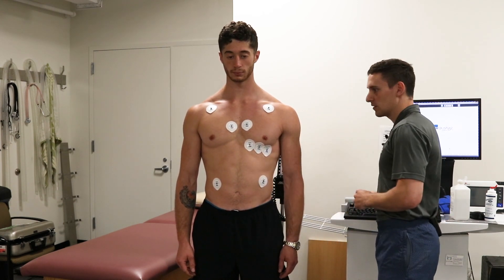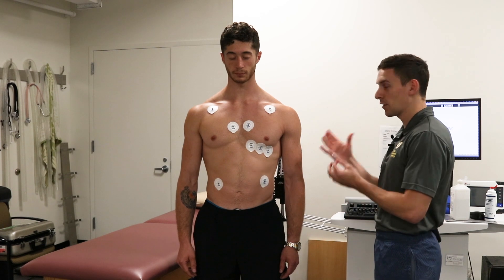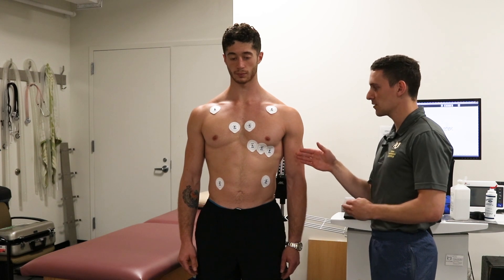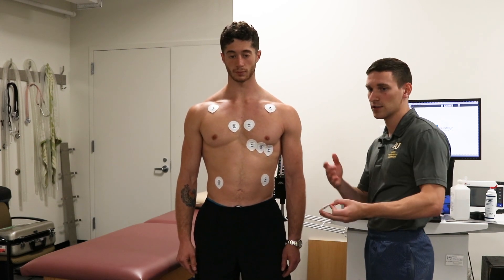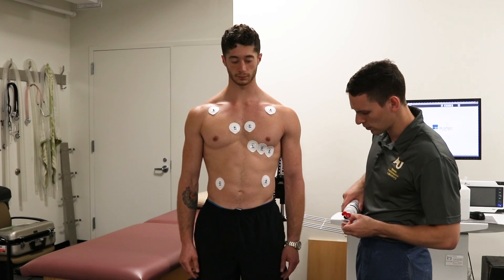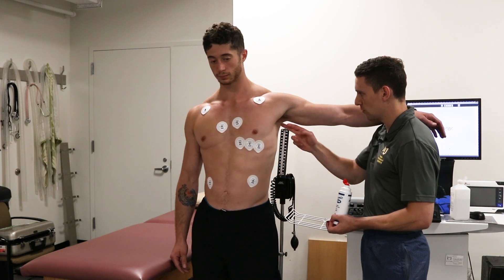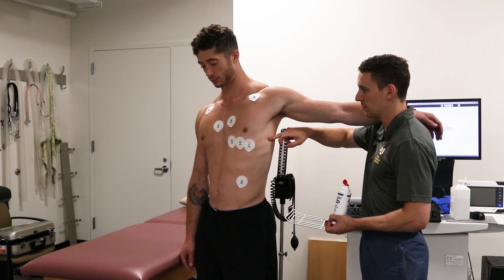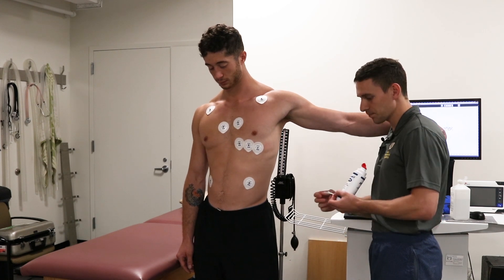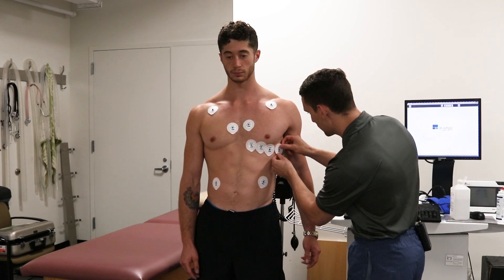Now for our V6 lead: V6 is placed along the fifth intercostal space in the mid-axillary line. Because we're going to be exercising, we're going to shift it a little bit further anteriorly so that the arm isn't rubbing against the lead during exercise and creating extra artifact. Had this been a sedentary test with no movement involved, we would have them lift up their arm, turn to the side, and place it along the fifth intercostal space directly on the mid-axillary line. For our purposes it's placed slightly anteriorly.